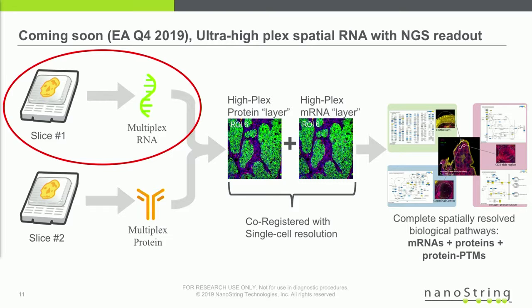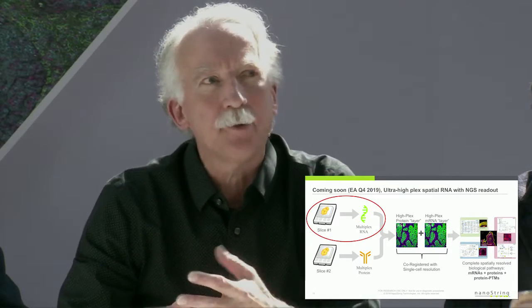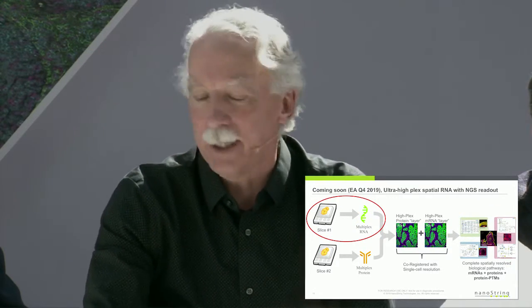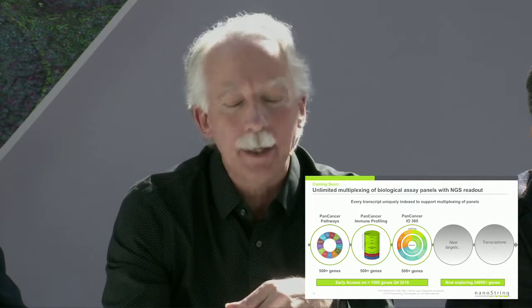And then in the analysis, you've got a totally combined analysis with the biomarkers from the RNA layer, the protein layer, and the protein post-translational modification layers all can be analyzed in a single integrated step. And this was really the heart of what we're trying to create.